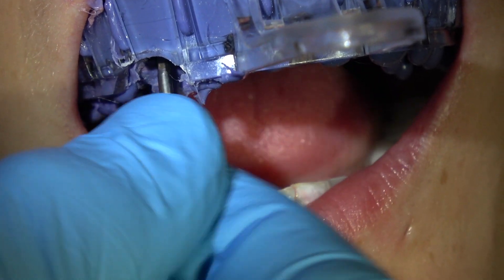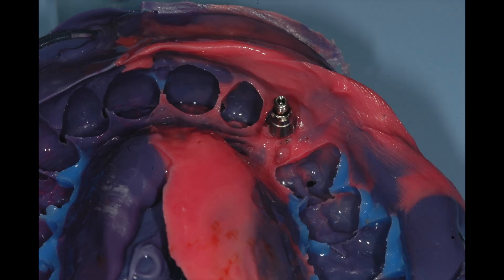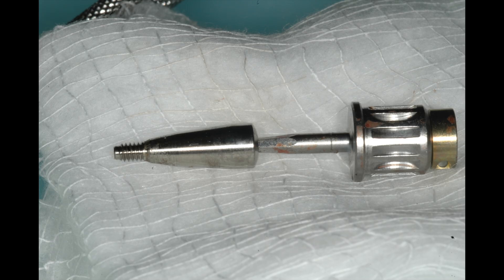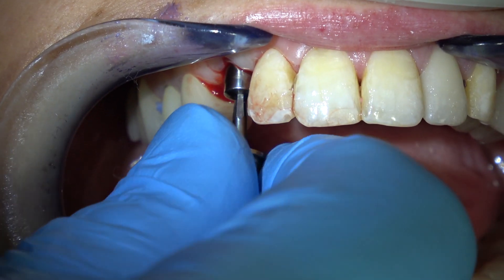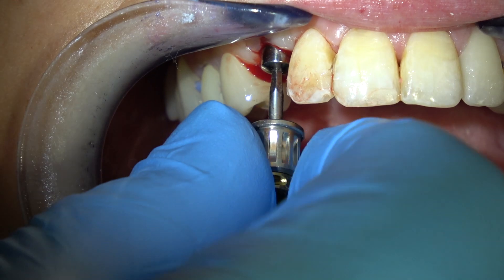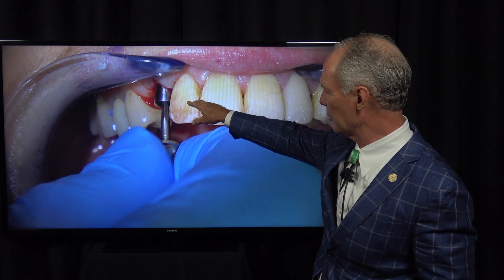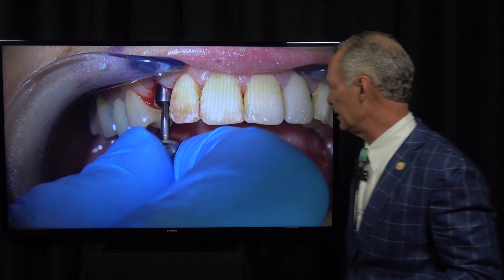Here's the impression coping in the hole. I'm going to remove that little bit and then unscrew and loosen the impression coping. Now I'm going to place the healing cap. You want to be sure that the healing cap places pressure on the soft tissue — that it's a little bit wider than the orifice between the gingival crest and the implant.